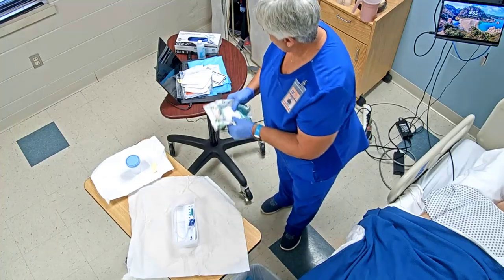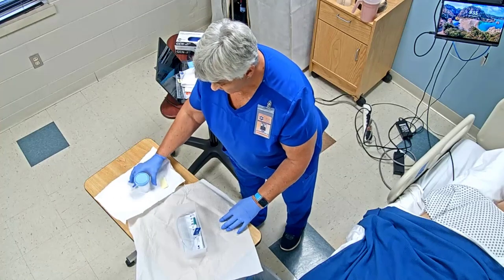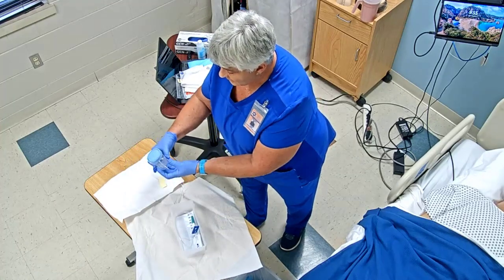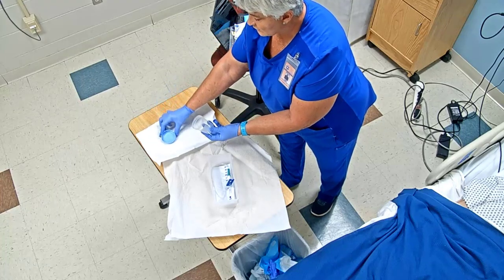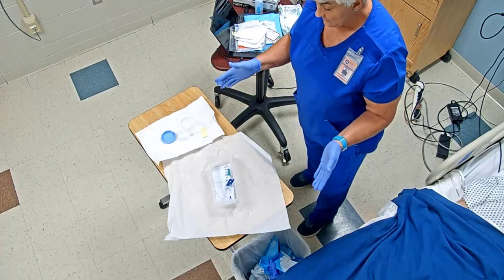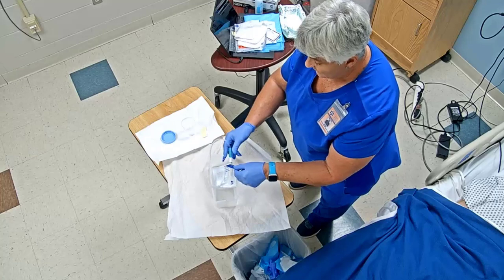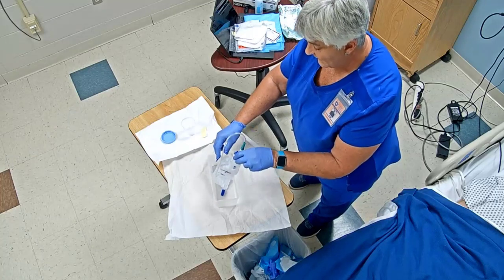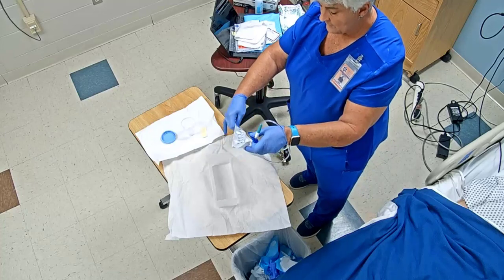But I need to get my specimen here. So I don't need that one right now. Okay, so I need to make sure that I keep this cup. So I'm going to go ahead and take the lid off. I need to make sure that I don't cross over the lid or the cup, and I don't turn my back on there. So I'm going to go ahead and get my catheter, and I've got my urine in here, okay?